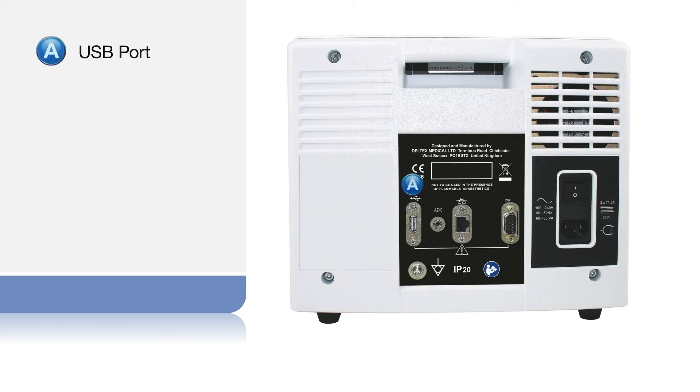are the USB port for downloading patient data, a round jack socket labelled ADC, which relays the arterial blood pressure measurement from the patient monitor. The Deltex Medical technical team can advise on cables required to connect the ODM Plus to your patient monitor.